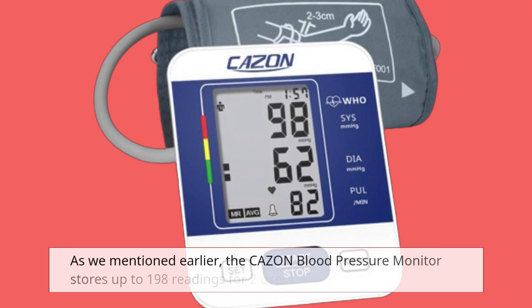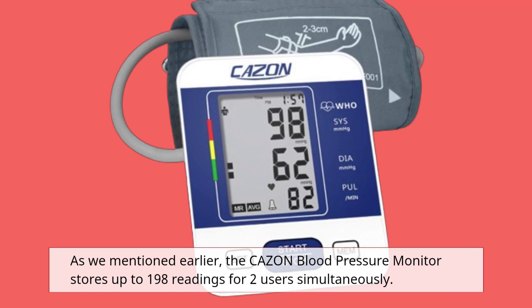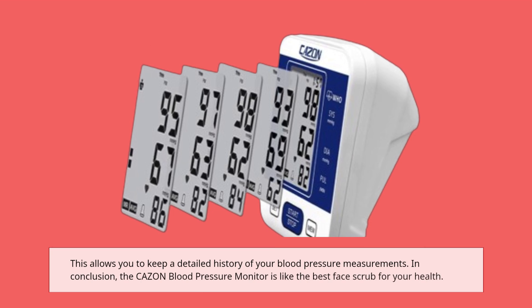The CAZON blood pressure monitor stores up to 198 readings for two users simultaneously, allowing you to keep a detailed history of your blood pressure measurements.